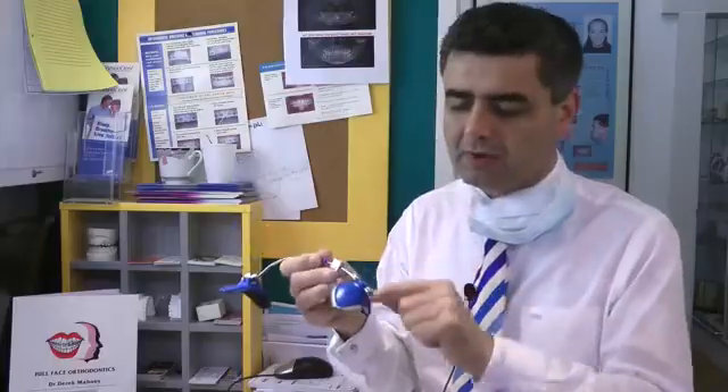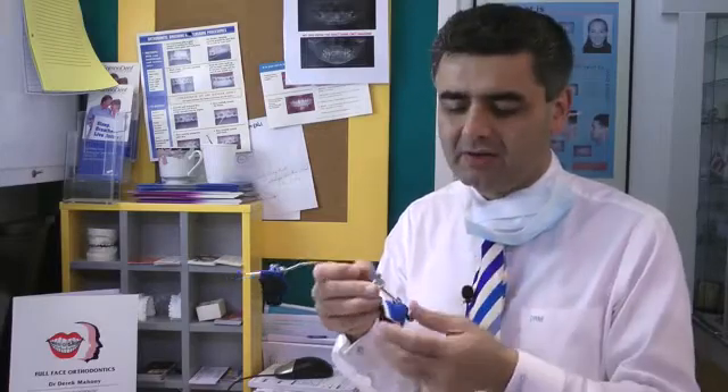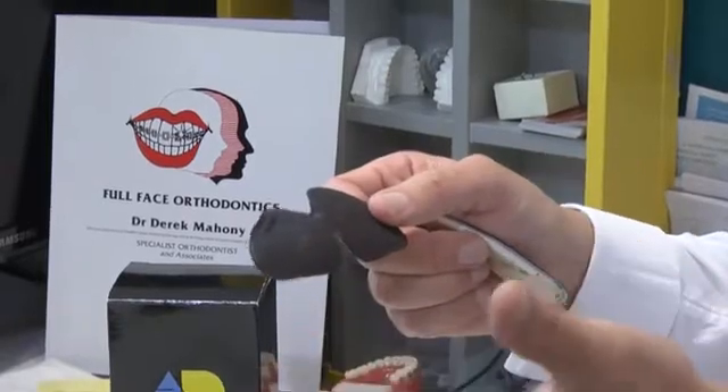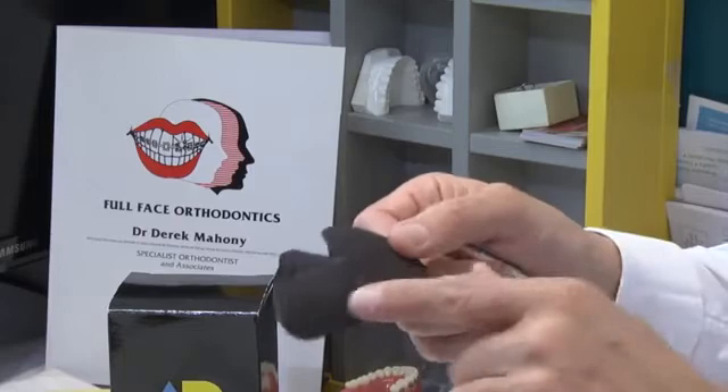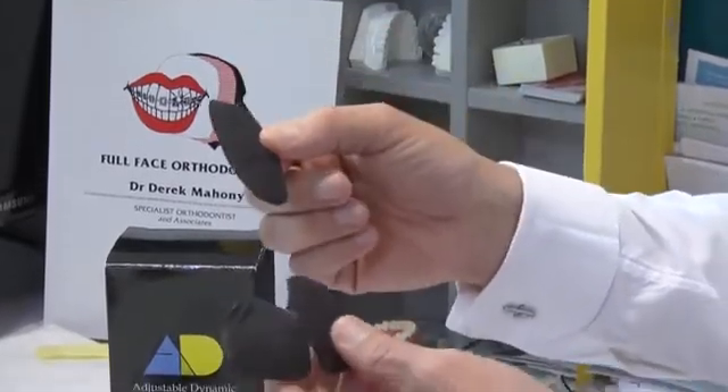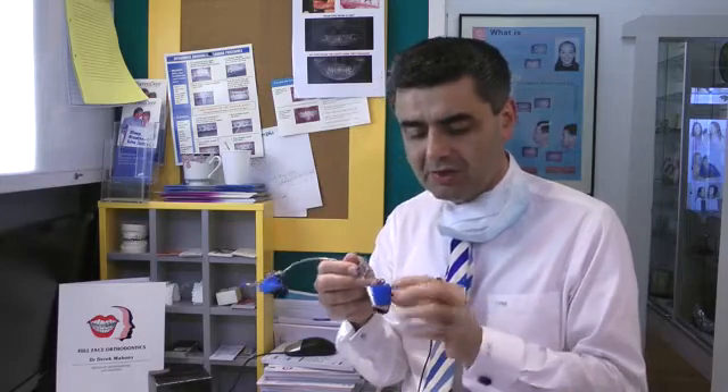In hot weather, particularly in countries like Australia, when children sleep with this, they tend to sweat a lot and sometimes you get a rash around the chin. There are two possibilities. One is you can get a round burr and drill holes in the chin cup so that they can breathe. The second is, rather than use the inserts given to you by the manufacturer, you can cut out the same design from what's called odor eaters — charcoal inserts for shoes. They're sticky on one side but have absorptive material on the other. So you get the patient to buy the odor eater shoe insoles and cut that shape out. That seems to work well. Most of the problem is sweating. If it's irritation, you can adjust these and we're going to show you how to customize them.